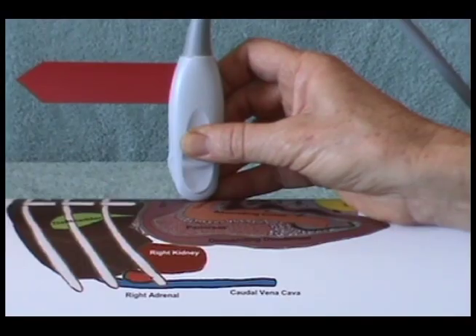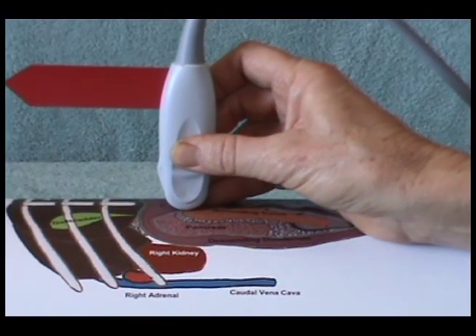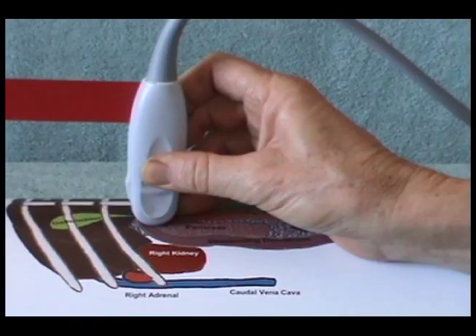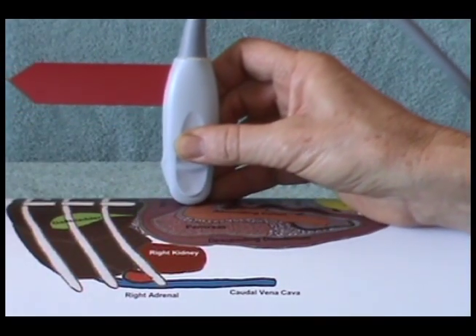Slide the transducer to the patient's right side till the stomach is no longer under the transducer. Reverse directions and slide to the patient's left side till the stomach is no longer under the transducer.